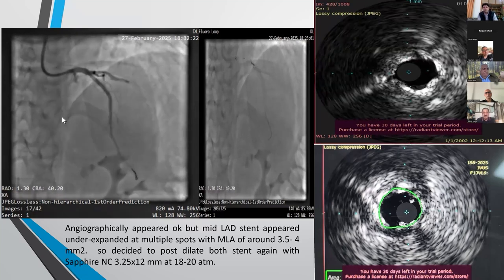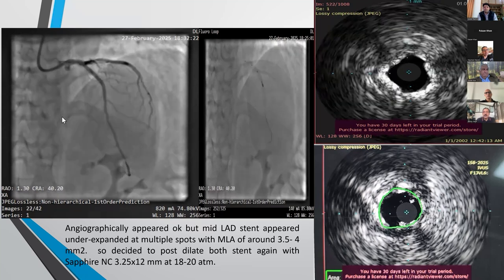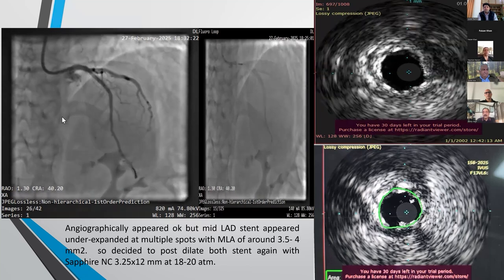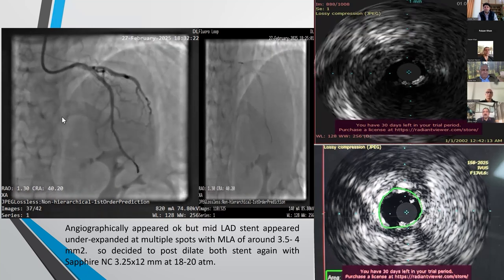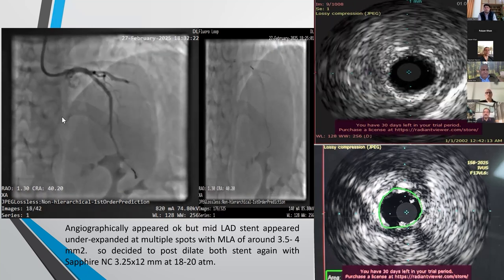But the most important thing, as Suhail said also, is to have a proper process of re-sterilization, and ideally it should be certified. Places that will be doing it have to demonstrate they have an adequate re-sterilization process in their institutions.